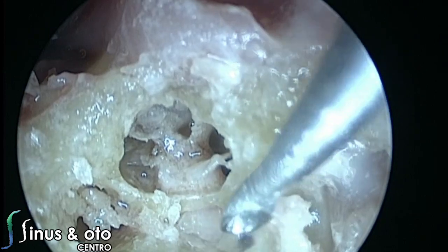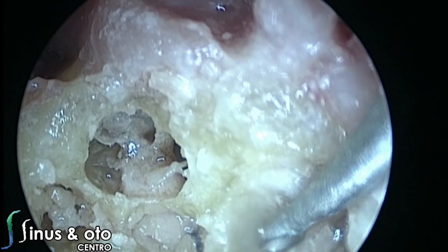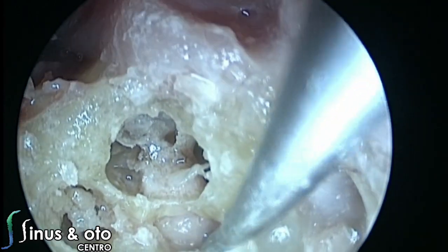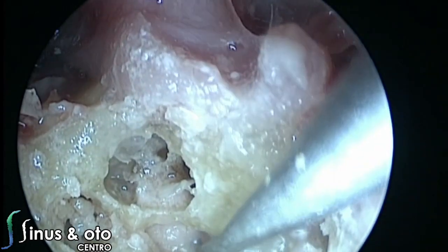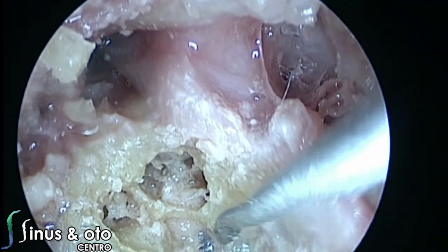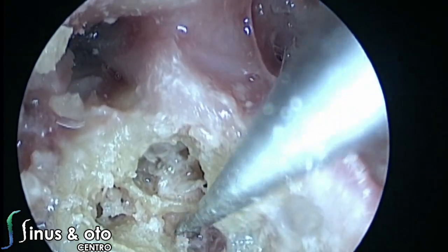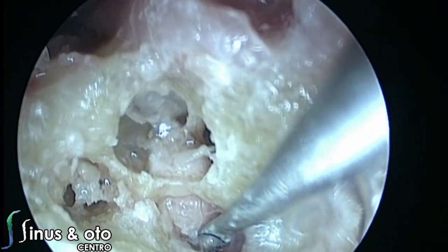We see there is a small membrane. We open this membrane, and once we open it, we are already inside the fundus of the internal auditory canal. So we saw in the vestibule the elliptical recess and the spherical recess, and now we open this small membrane to go inside the internal auditory canal to see the cranial nerves. Inside, we will see the cochlear nerve in the left. Above the cochlear nerve, we have the facial nerve, and in the right, we will see the two vestibular nerves, the superior vestibular nerve and the inferior vestibular nerve.